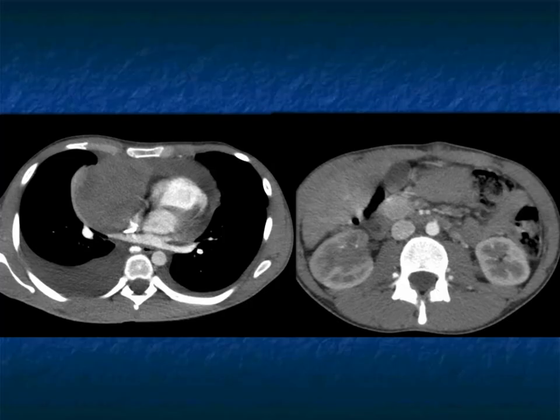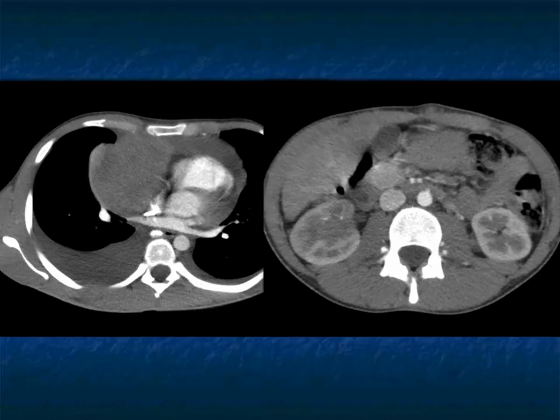So when you're staging patients, and you're asking what that mediastinal mass is, remember, with thymoma, we're not going to see anything in the abdomen typically. We're not going to see things with substernal extension of the thyroid, obviously. But when we see involvement of the kidneys, the liver, or the spleen, or bulky nodes, we've got to be thinking that we're dealing with lymphoma.